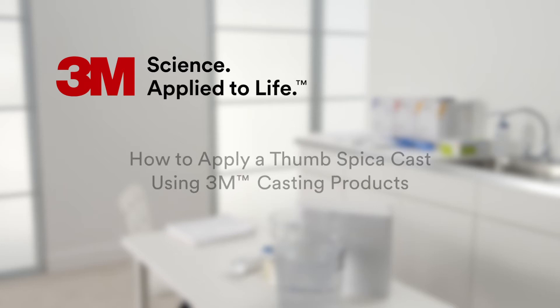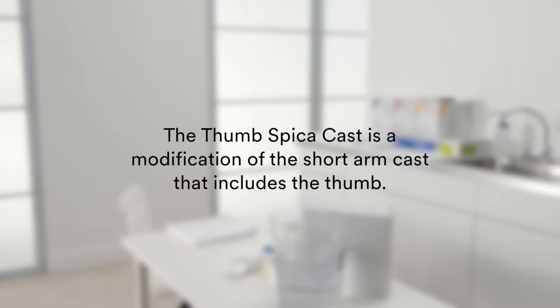This tutorial provides step-by-step instructions for the application of a Thumb Spica cast using 3M Casting products. The Thumb Spica cast is a modification of the short arm cast that includes the thumb.